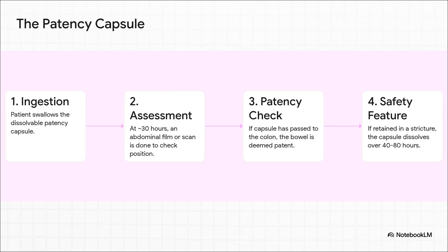So for these high-risk folks, what do we do? We use this really smart solution called a patency capsule. The best way to think about it is like sending in a scout.